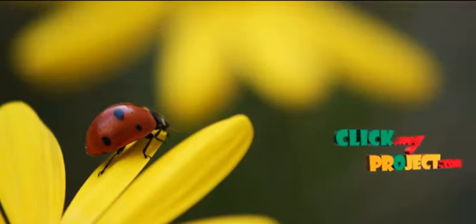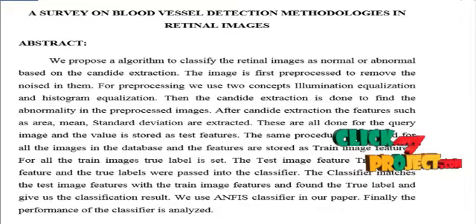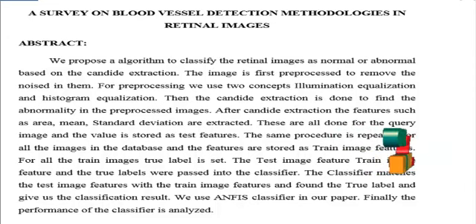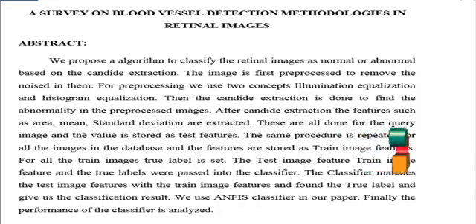ClickMyProject.com, that we discuss about the process, a survey on blood vessel detection in retinal images. Let me see the abstract of the process. We propose an algorithm to classify the retinal images as normal or abnormal based on the candidate extraction.